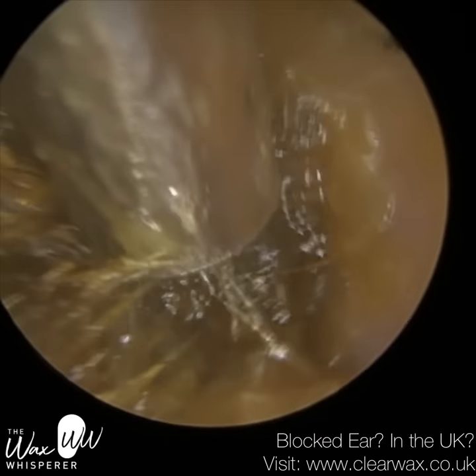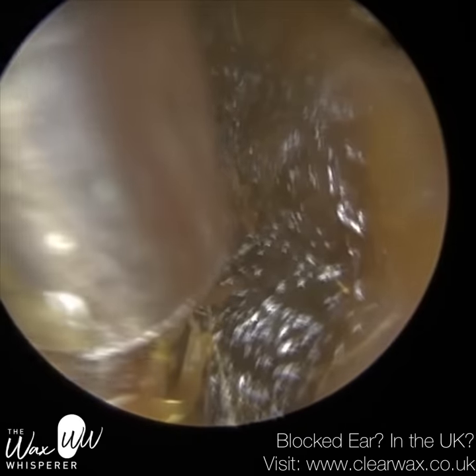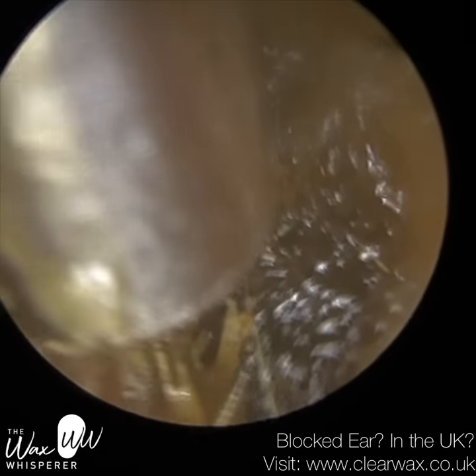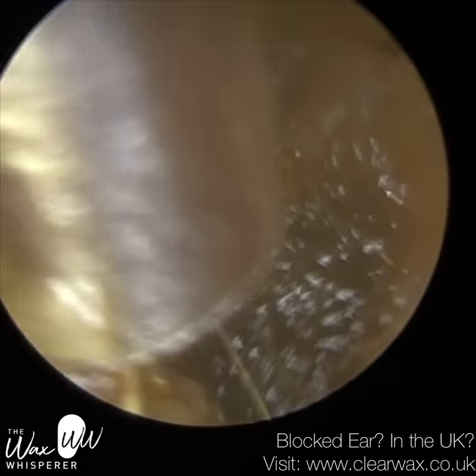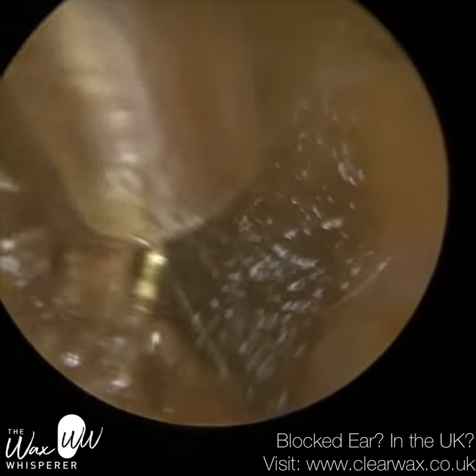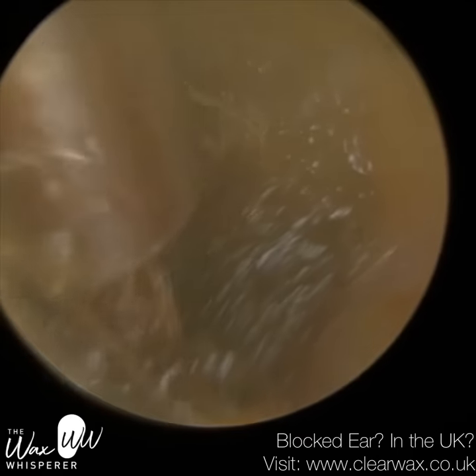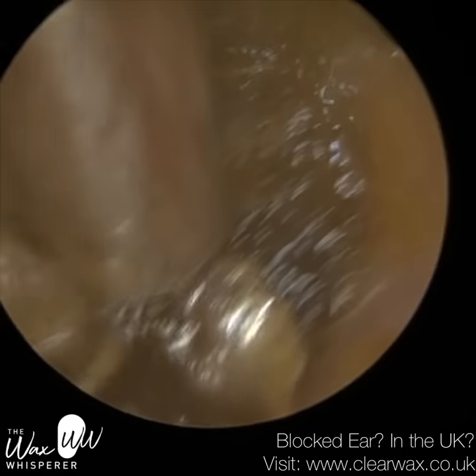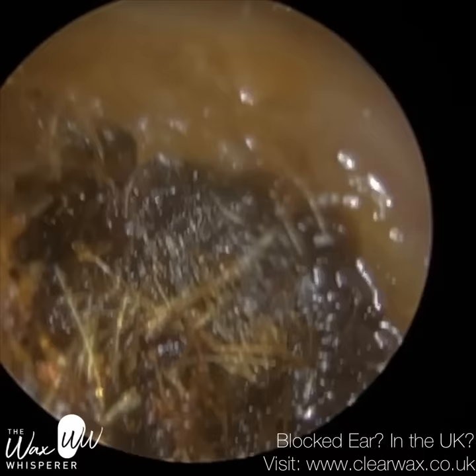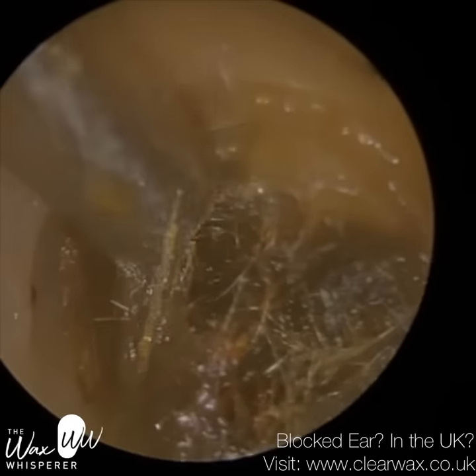At the moment, I'm not sure exactly where the ear canal is posteriorly. I can see the ear canal to the right, anteriorly, but posteriorly, I just want to reveal some of the ear canal. So I've then got an idea of my boundaries. When you can't see the ear canal and you're using an instrument, you're always, at the back of your mind, going to be wary whether you make contact with the canal wall. So if you embed the instrument too much into the wax, I always like seeing some ear canal around the edge, and it just helps me to plan the rest of the procedure.